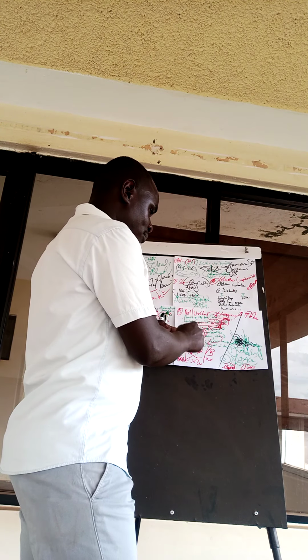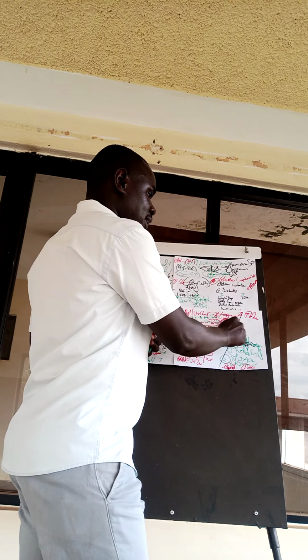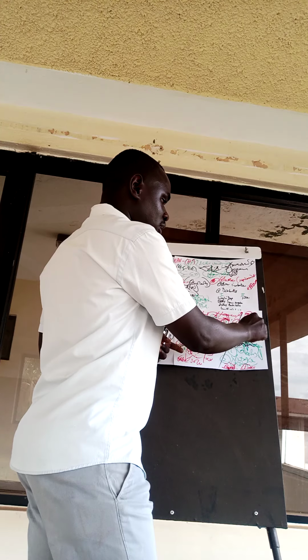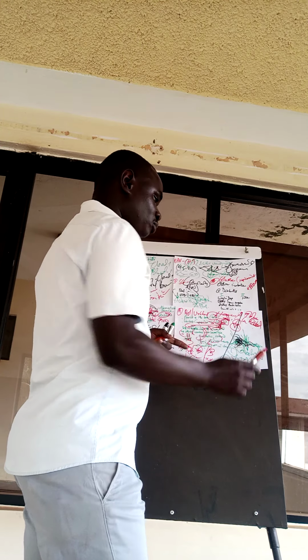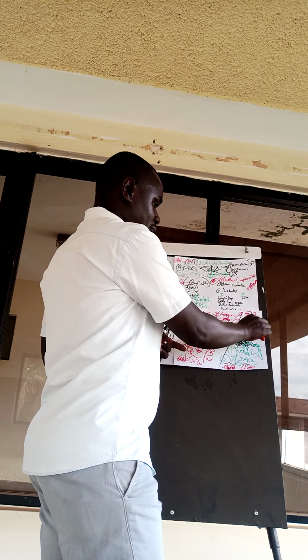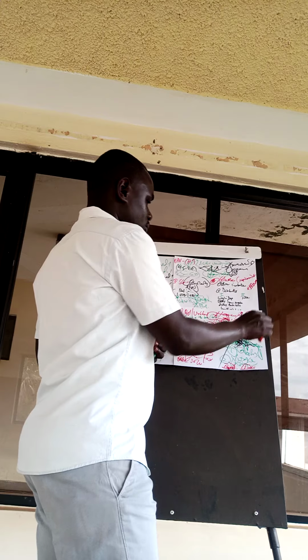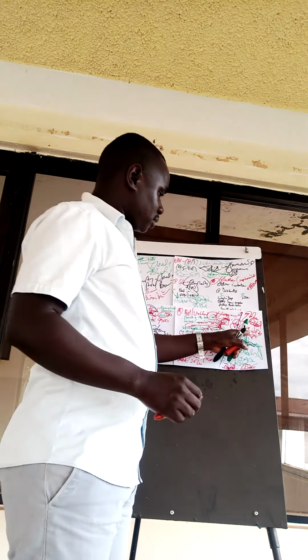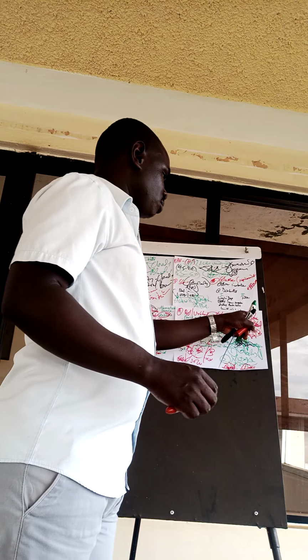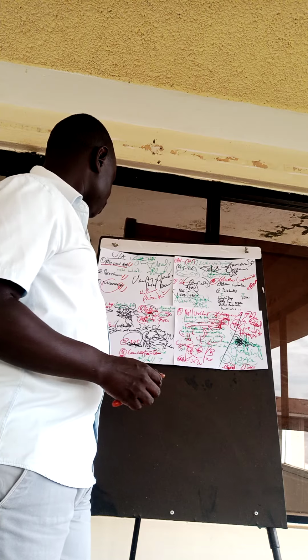So the presence of urobilinogen is an indication of, one, increased hemolysis of red blood cells. Two, there could be liver disease or hepatocellular disease. So that is about the bilirubin, an indication of hemolysis or liver disease or hepatocellular disease.